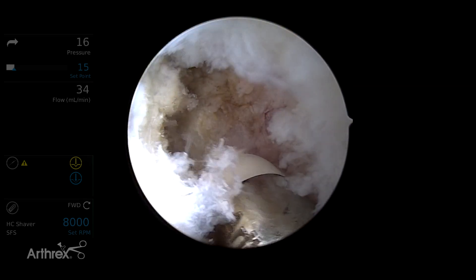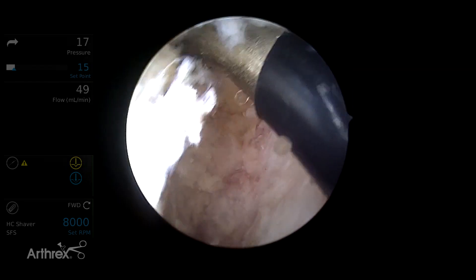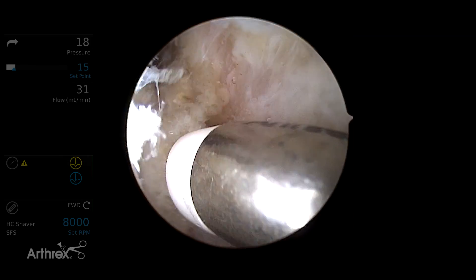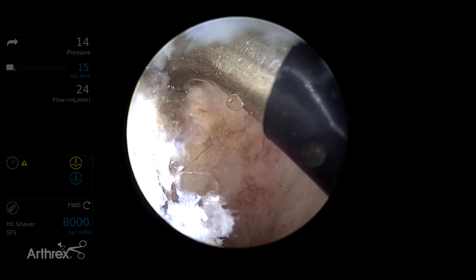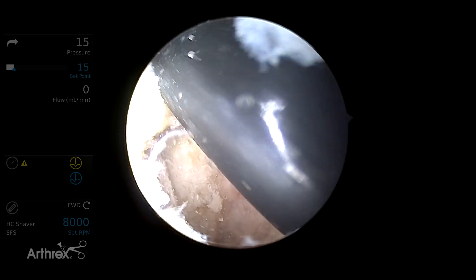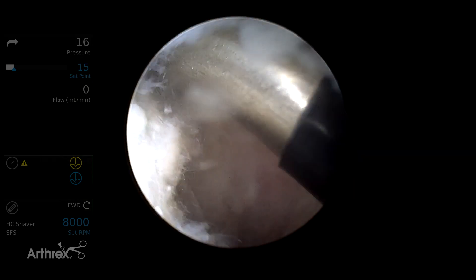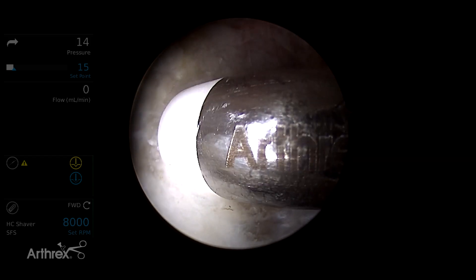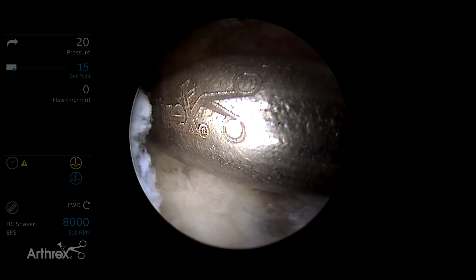One of the problems with anchor placement is coming in the anterior position across the psoas recess, which is anterior at the 3 o'clock position. To ensure that I do not violate this recess, I bring the Apollo wand at a 50-degree curve over the anterior rim. You can see it falling into the psoas recess. You can then define this with minimal dissection so that when you put your anchor at the 2 to 3 o'clock position, you ensure you don't violate the psoas recess.